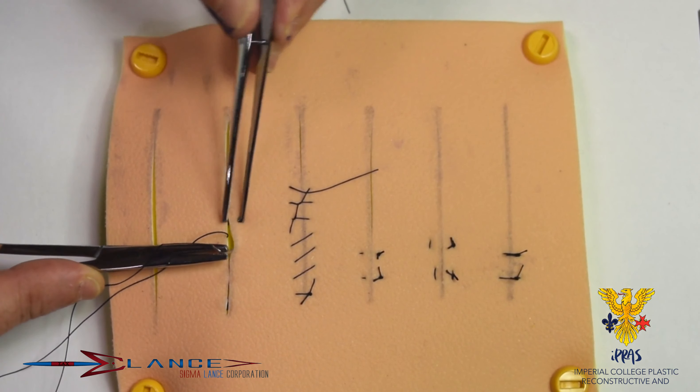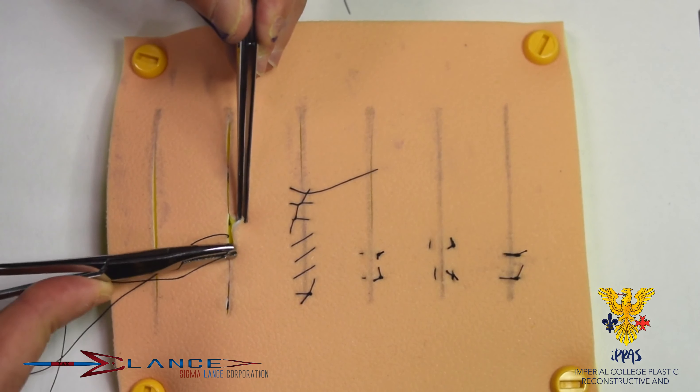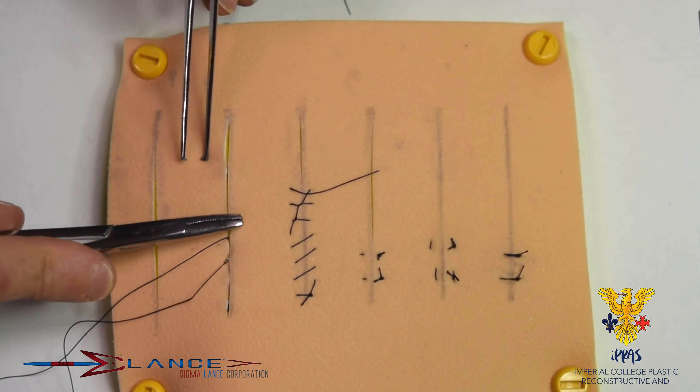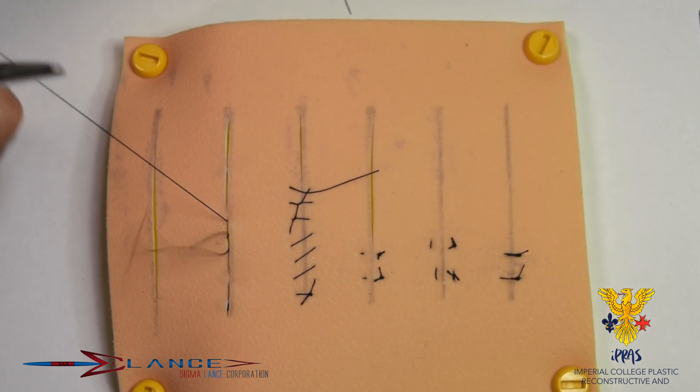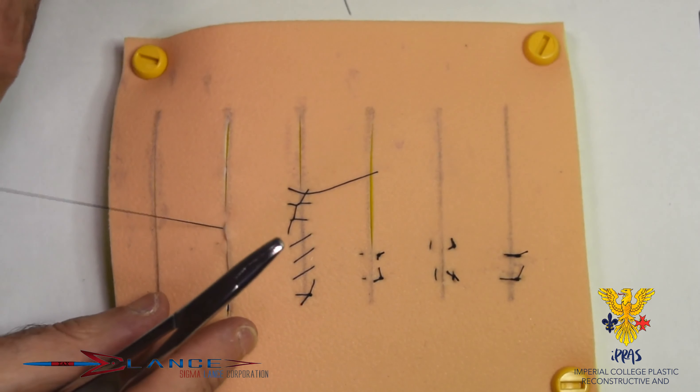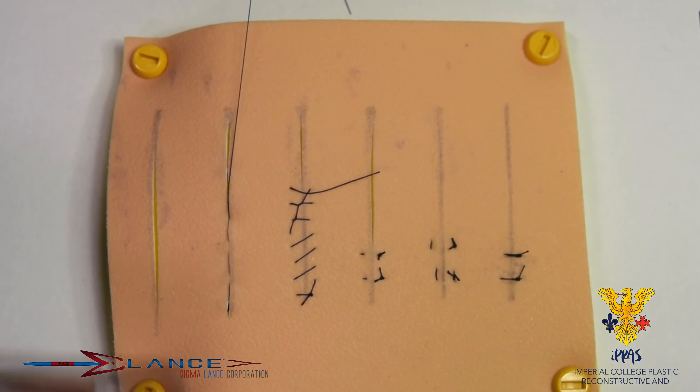Don't worry if you struggle this exercise a little bit, the dermis is a little bit thin here. The kit is perhaps not as good as you can get in theatre, but that's the principle in terms of closing it. What you should be getting is a good closure, something like that.